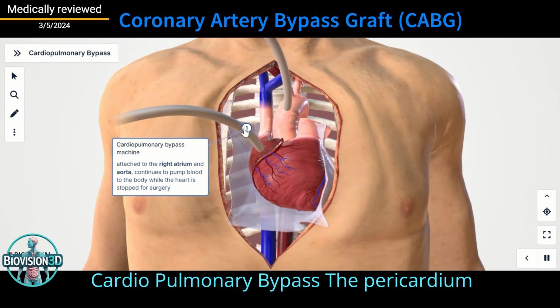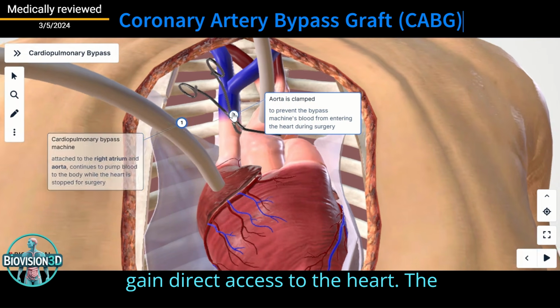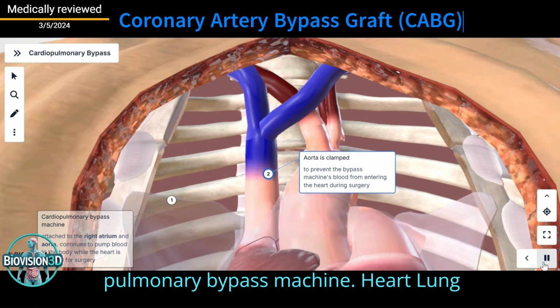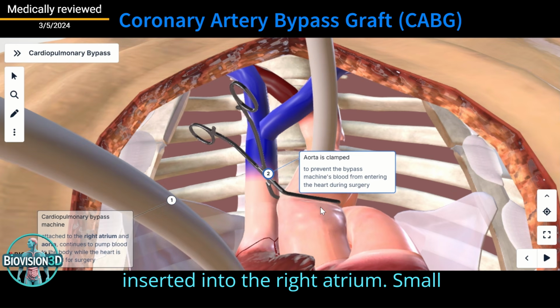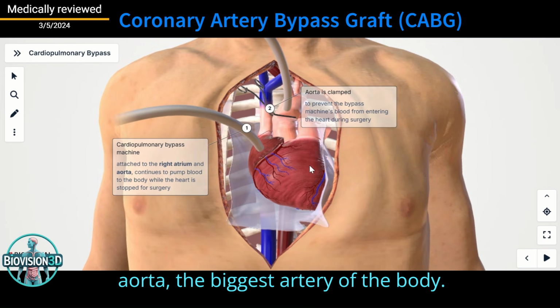Cardiopulmonary bypass. The pericardium, protective, fluid-filled sac, is open to gain direct access to the heart. The heart will be connected to a cardiopulmonary bypass machine, heart-lung machine. Cannulas, hollow tubes, will be inserted into the right atrium, small pumping chamber of the heart, and the aorta, the biggest artery of the body.